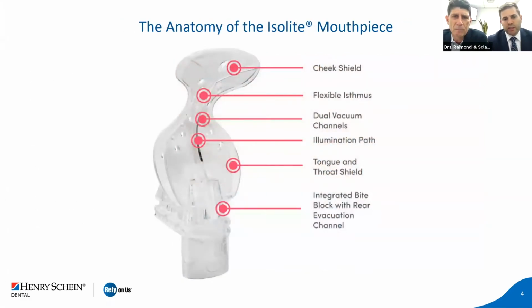So again, here is the apparatus, right? Again, it looks big. If I haven't worked with it for a few months, I would look at this and say, wow, will my patients accept this? Especially in the current environment, being in New York, New Yorkers are great. I'm impressed by our fellow New Yorkers and how good they are at masks and everything else. Whenever I tell a patient we use this because of COVID, but we find that it's great regardless, it's almost adopted 100% of the time. Is it 100%? No, but is it over 90? Yes.